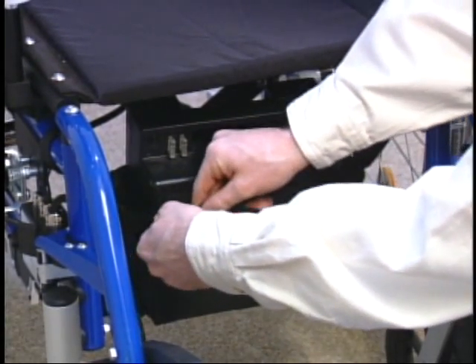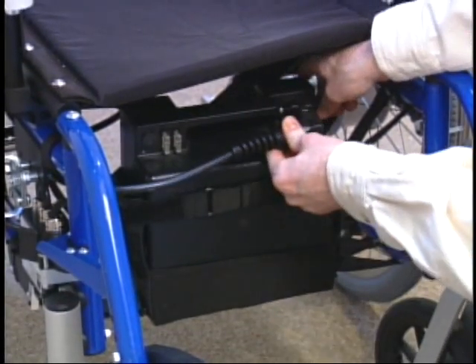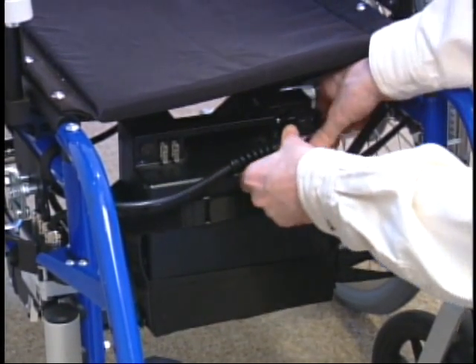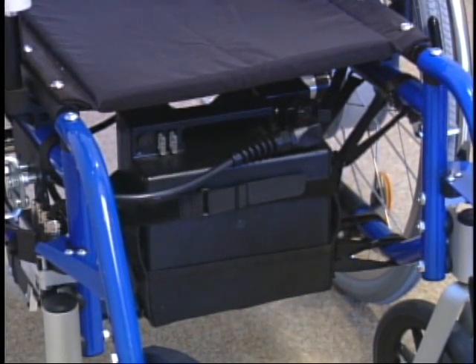The Velcro battery pouch holds the battery pack containing the sealed gel cell batteries, which are approved for airline travel. A single central plug connects the battery to the electronic system.